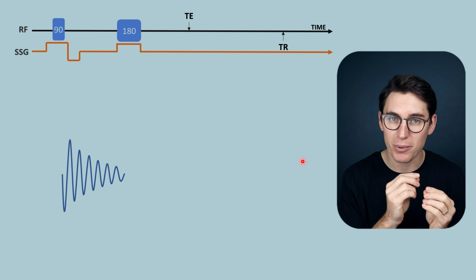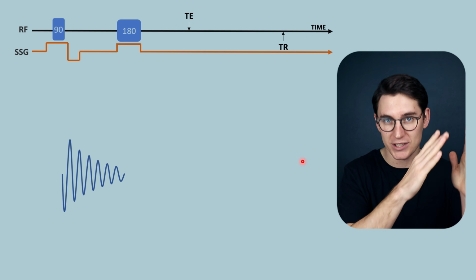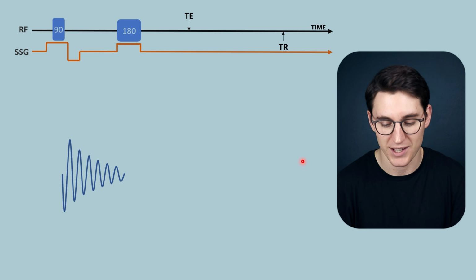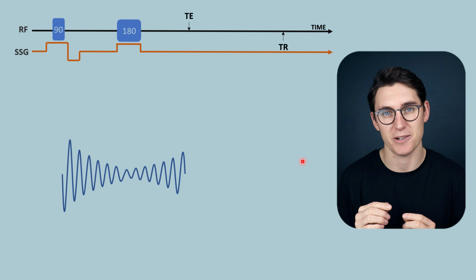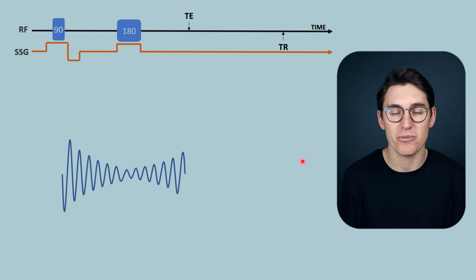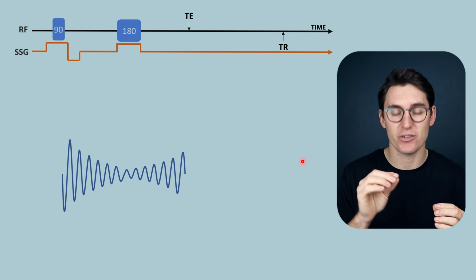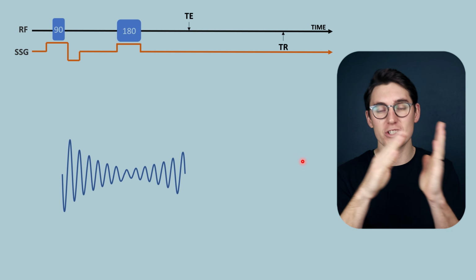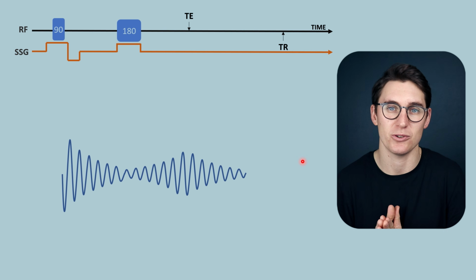We then apply a 180-degree RF pulse that allows those spins that were dephasing at the free induction decay rate to then rephase with one another. And that rephasing causes gain again of that transverse magnetization vector. Remember, transverse magnetization vector is predominantly a measure of how in phase those spins are in the transverse plane. Again, then, that transverse magnetization vector will reach its maximum transverse magnetization once those spins have rephased, and then they will continue to dephase again at the rate of T2 star.